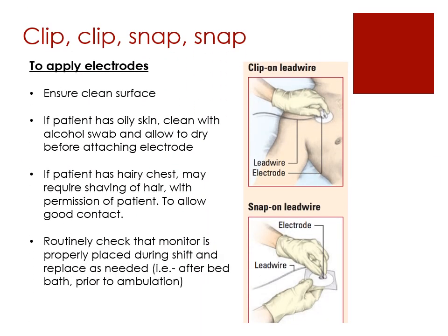If you have to put telemetry on a person, please snap on the lead wires first and then take off the little sticky part and put it on the chest. Don't put the sticky stuff on and then try to put the pegs on there, because you have to push down, and that can cause some really uncomfortable pressure for the patient. So we always say, snip, clip, clip, snap, snap, meaning click on the little electrodes first.